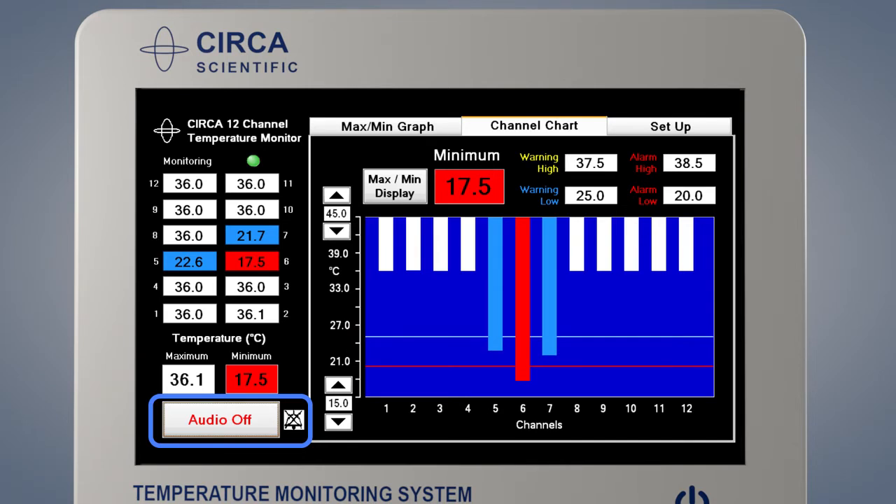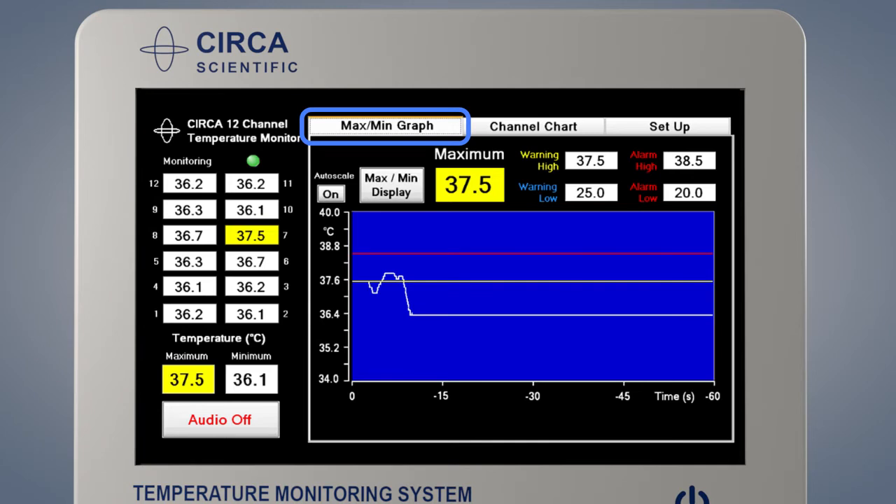The audio off button may be pressed to temporarily silence the alarm. The alarm will be silenced until the next time the temperature crosses a warning or alarm threshold. By pressing the max-min graph tab, the temperature data may be displayed in a different format. The max-min graph display shows only the highest or lowest temperature graphed over the last 60 seconds. This display indicates the temperature and the rate of change. The alarm settings and functions operate in the same manner as the channel chart screen.